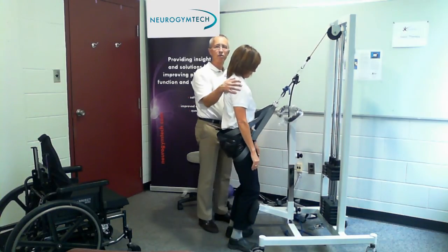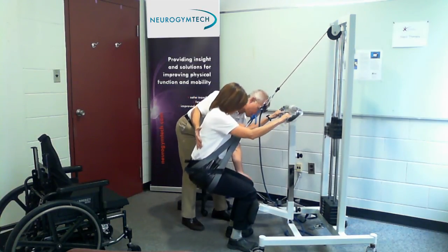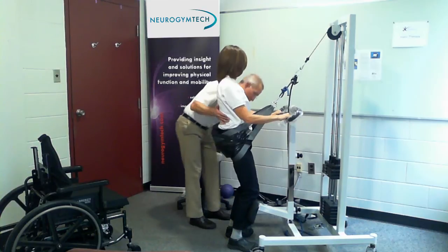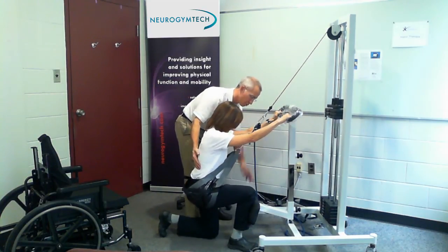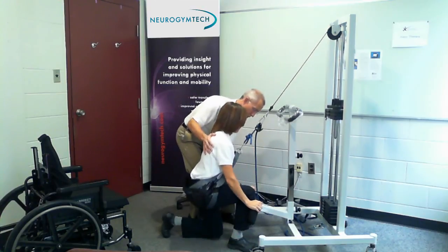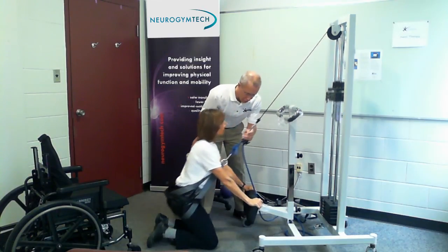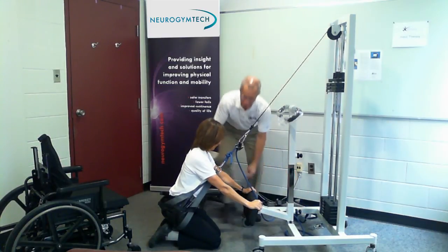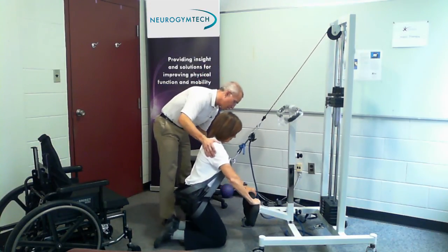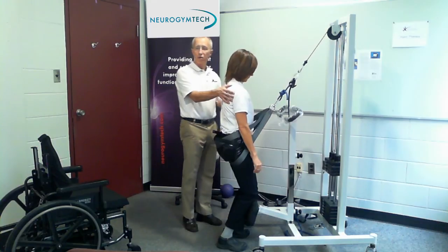First I should check the range of motion of the knee — put your hands here and come all the way down with both knees touching, and then up. The range of motion of the knees is fine to do this. Then you would move to put your left knee down, both hands down on the pretend couch, and come on up. Let's do that a couple of times — up and down, up and down. Now we're going to put both knees on the ground, drop the right knee and sit back as if you've fallen. We're going to move the pretend couch down as low as we can — I'm guiding her so she doesn't fall over. We're going to crawl over to the couch, get that right knee up, keep that heel on the ground, and come on up. You do that over and over and over.